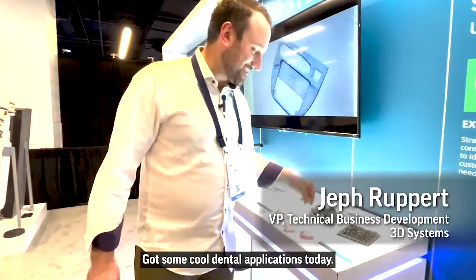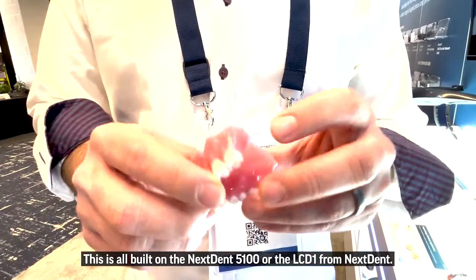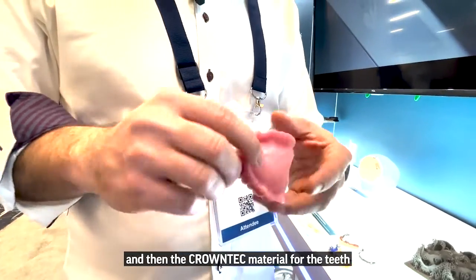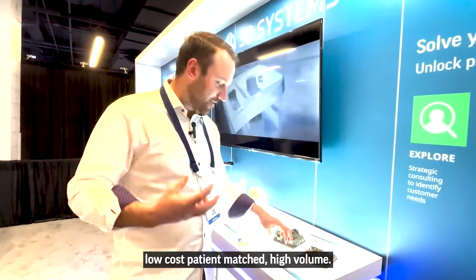We've got some cool dental applications today. This is all built on the NextDent 5100 or the LCD1 from NextDent. It's two different materials — the base material is the denture base, and then the CROWNTEC material for the teeth assembled afterwards. Super high resolution and easy to print, low cost, patient-matched, high volume.